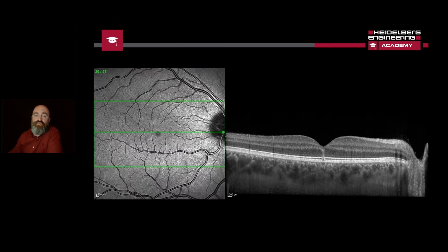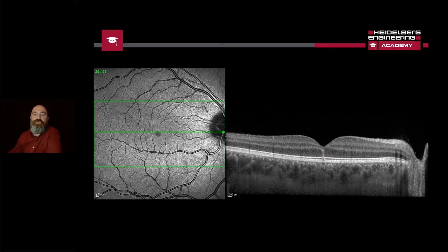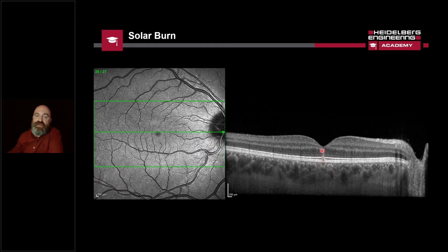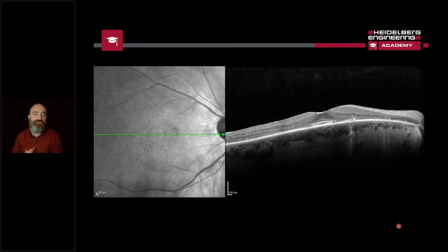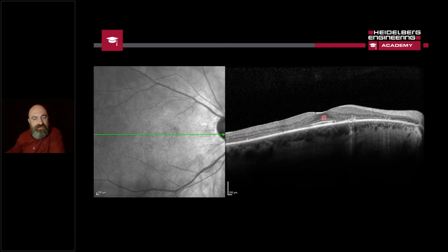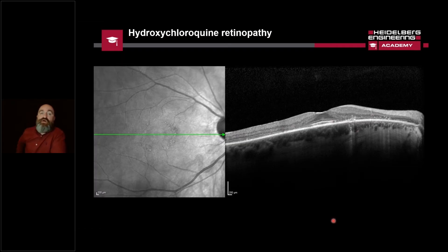Some pathologies like this one here can actually be quite hard to see at first appearance, but when you look very closely, you can recognise there's a bit of hyperreflective material at the centre of this fovea — that ties in with a solar burn. What's happened is this patient's eye, and this was actually a bilateral case, has stared at the sun too long, which has zapped that part of the central fovea. Another very common condition is where you can see something on the infrared, but when you look at the retinal layers, you can see that the outer nuclear layer is actually missing — that's very common with hydroxychloroquine retinopathy or toxicity.